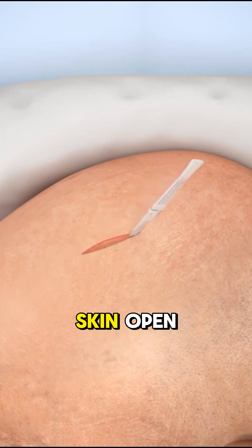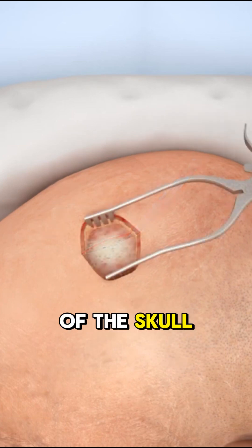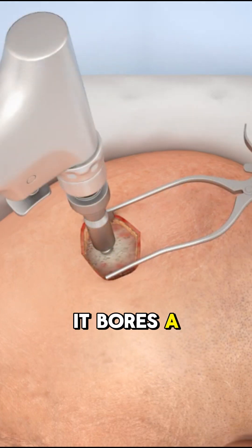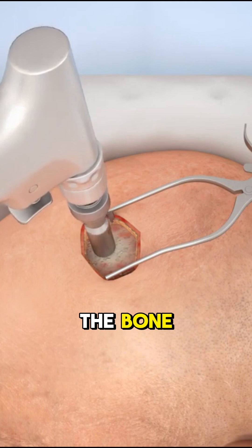Retractors pull the skin open, giving the surgeon a clear view of the skull. Now the Midas-Rex drill comes in — it bores a hole straight through the skull, right into the bone.